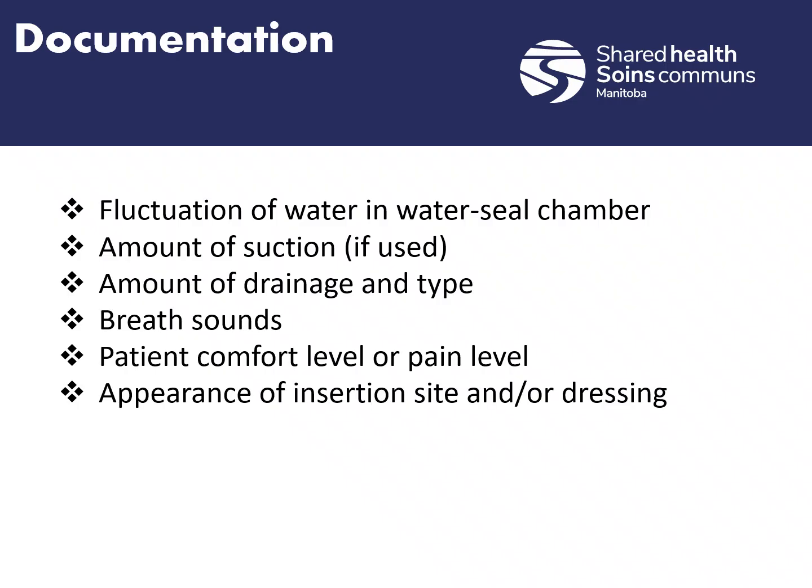And appearance of insertion site or dressing. So again, if we pick it up, they've got a nice clean dressing on there. And as we get to the receiving facility, it looks like there's some kind of pus soaking through, or maybe just a little bit of blood. That is definitely something we want to document and report as well. Or did the dressing completely fall off and we had to makeshift one ourselves? That's something of note as well.